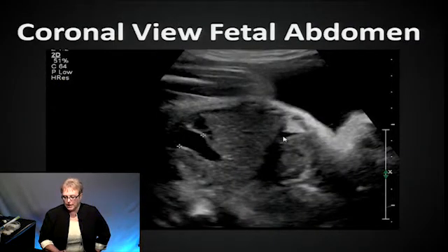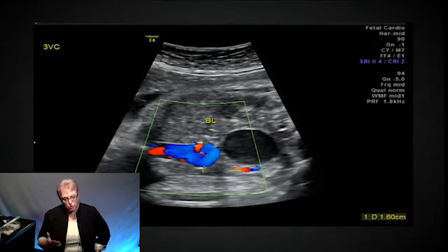Looking at a coronal again, looking at part of the heart, the diaphragm. This is coming right up, the umbilical vein coming up into the liver. Look at this little area here. Remember, if there's measurements on it or if it's labeled or has numbers, it's something we want to look at. Look at the size of this compared to that. It's 12.8 millimeters. And then put color on.